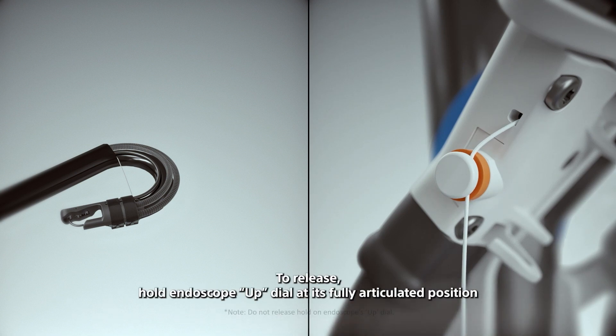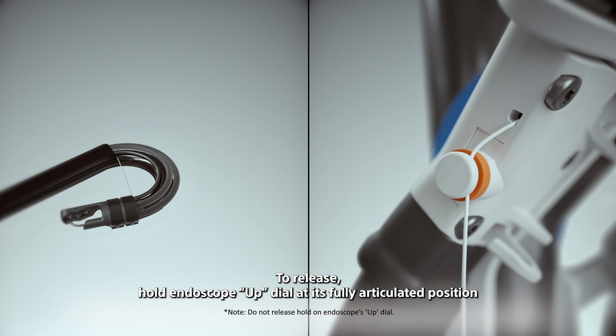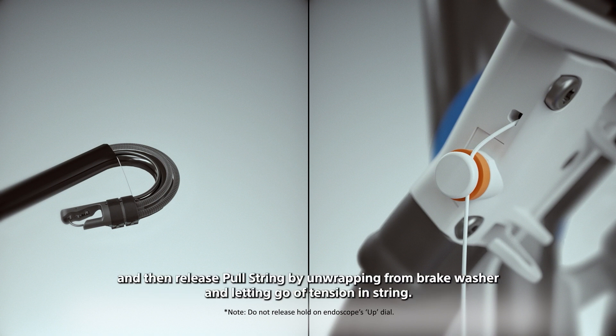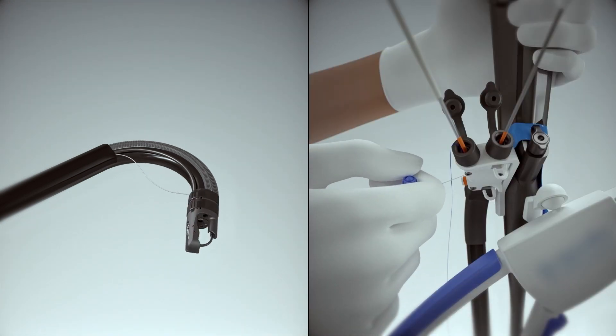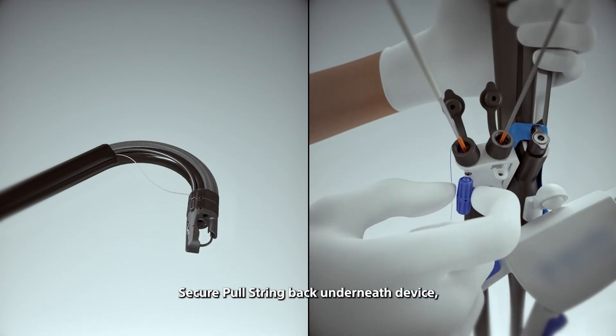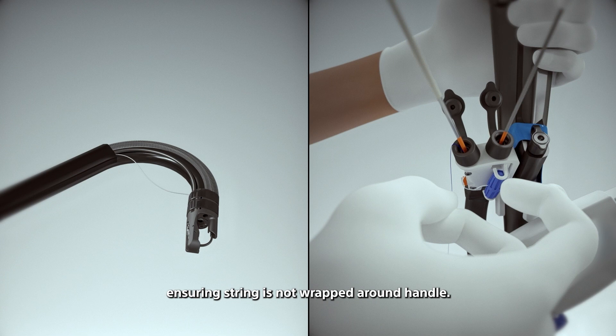To release, hold endoscope up dial at its fully articulated position and then release pull string by unwrapping from brake washer and letting go of tension and string. Secure pull string back underneath the vice, ensuring string is not wrapped around handle. Release scope dial.